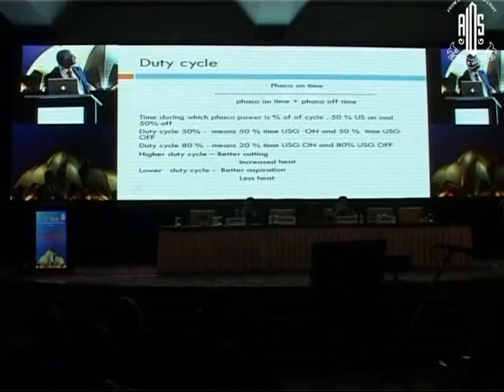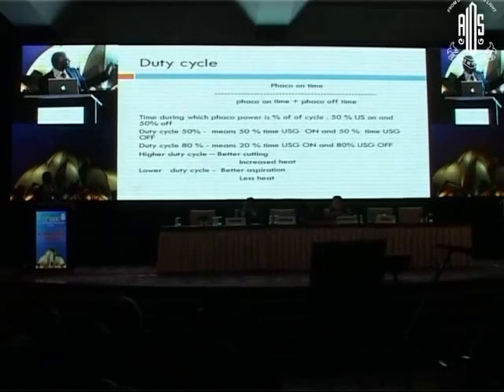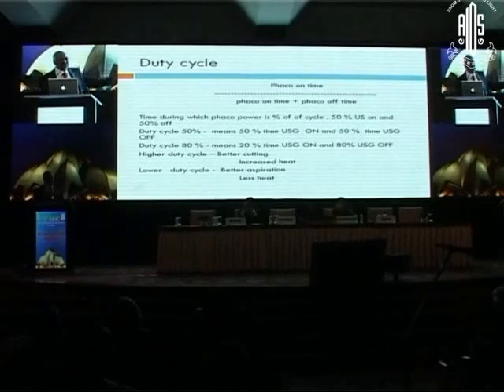Now this is the duty cycle. You can see 50 or 80 and 20. Accordingly, it increases the phaco power.